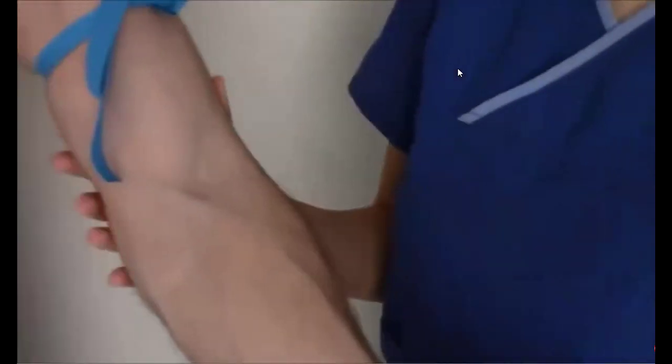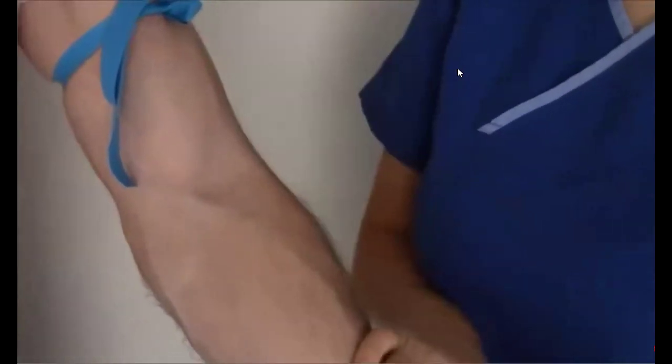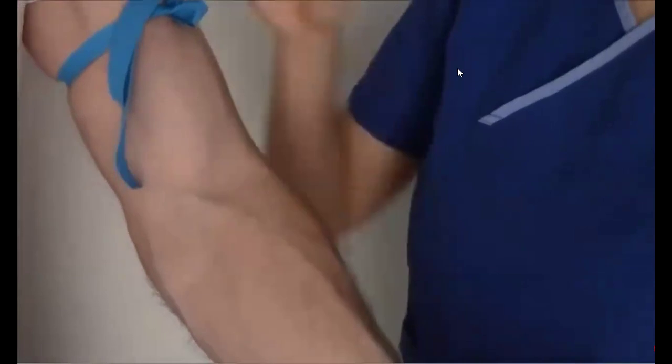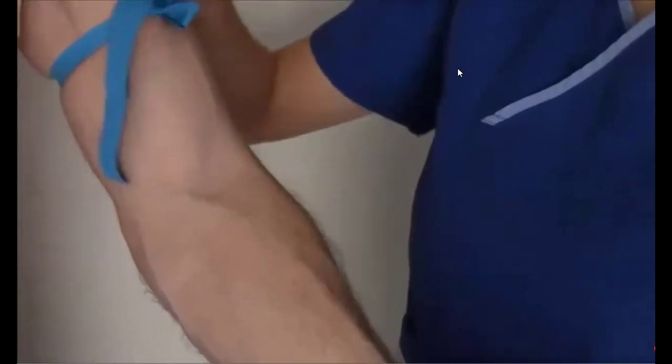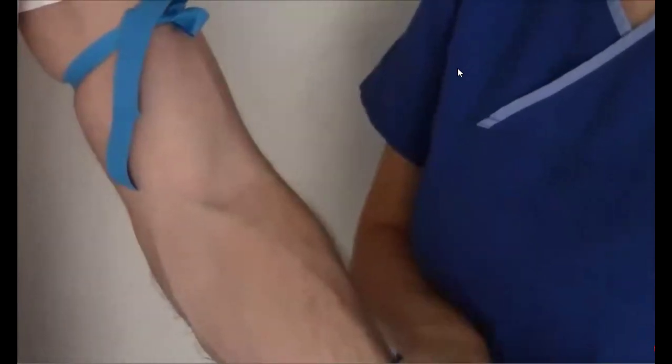So I'm going to talk about the different areas that we typically start an IV on. You always like to use the hand or the arm. We very rarely go up into the shoulder or anything like that. That's usually on really patients who are hard to stick. Typically, the arm is sufficient enough.